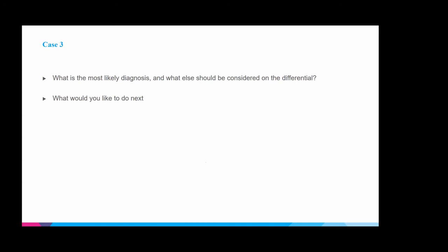So really the only other thing is probably some type of obstructive lung disease, whether it's COPD or asthma, right? They might be in an exacerbation without having a focal consolidation as a cause of the exacerbation. Usually, obviously, if that's the case, you would hear wheezing most likely on physical exam, but it's something that can also mimic a normal A-line pattern when you ultrasound the patient. So those are really the main considerations, PE or COPD exacerbation.